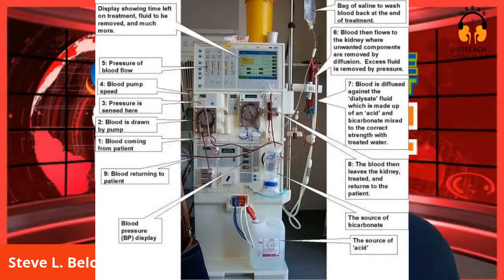Number three is the arterial pressure monitor alarm - it monitors the arterial pressure from your needle. Number four is blood pump speed, which again keeps the blood flowing from the body to the dialyzer and back. That's where you can see the speed, whether it's 300, 350, or 400. Number five is the pressure of blood flow.